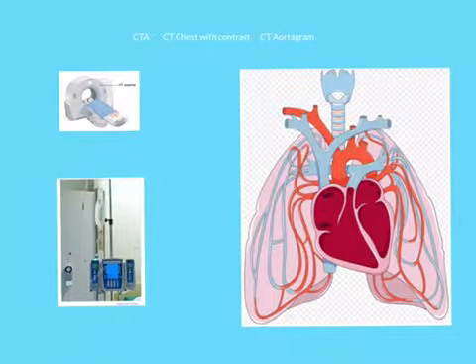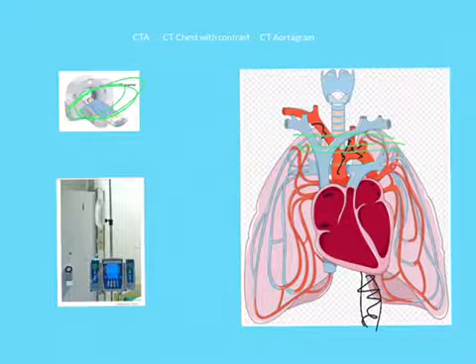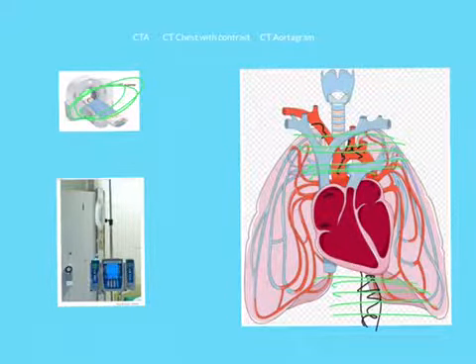So finally, when the bolus is in here, here, here, here in the aorta, and down over here in the aorta, you fire up your CAT scanner over here, and you start shooting this area over here, and you're looking at the aorta. That's a CT aortogram. Hope that makes the distinction between all three of those tests clear.